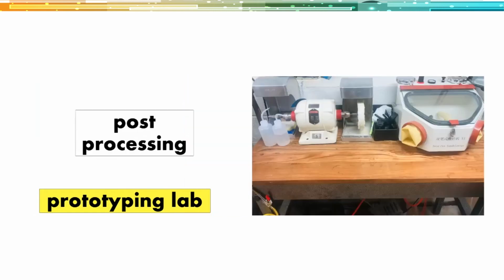It doesn't cost a lot of money to put together a little laboratory. You get a little air compressor. You can run a micro etcher from the air compressor. You have compressed air to blow the dust and liquid out. You have a lathe there. I just kind of moved these things from my office into this home lab.